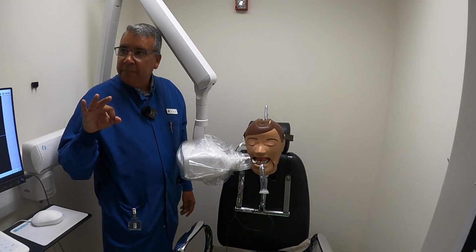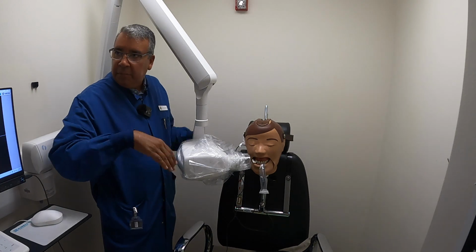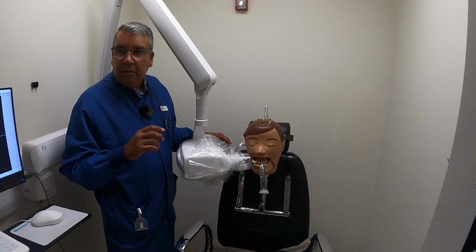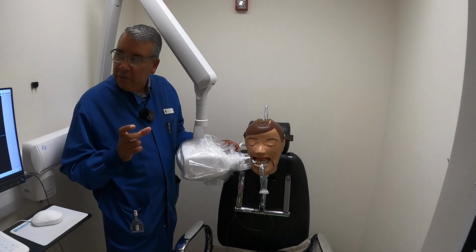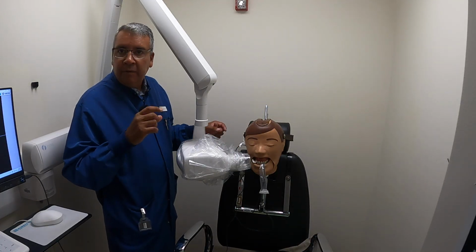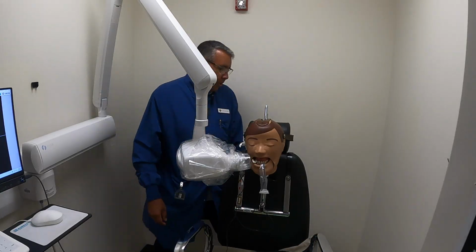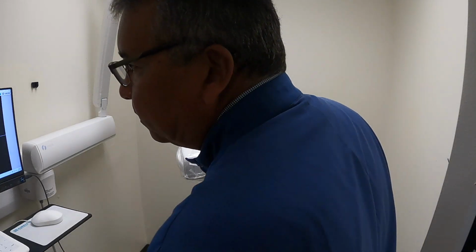Each one of those has a little thing you have to do in there. Vertical, you got to put it on 0, and there's going to be more to that later. Horizontal, how do you find your horizontal? It is the horizontal angle of the teeth you are trying to take. Once you find that out, then we cover the film. So here, I'm going to go around this way, and I'm going to go ahead and take that picture.